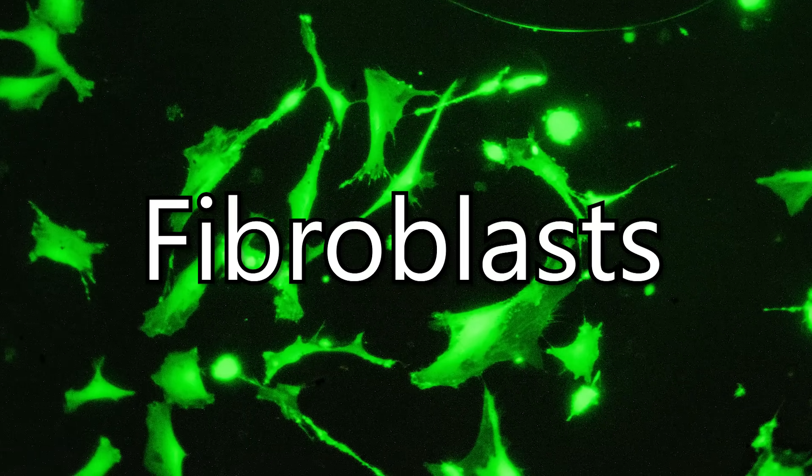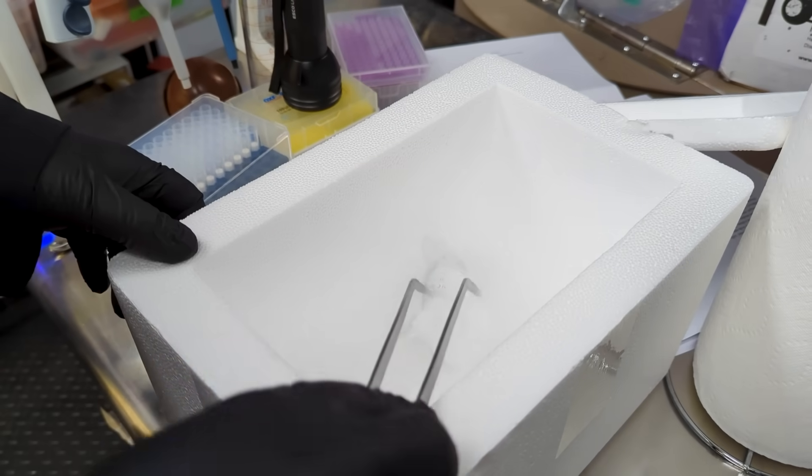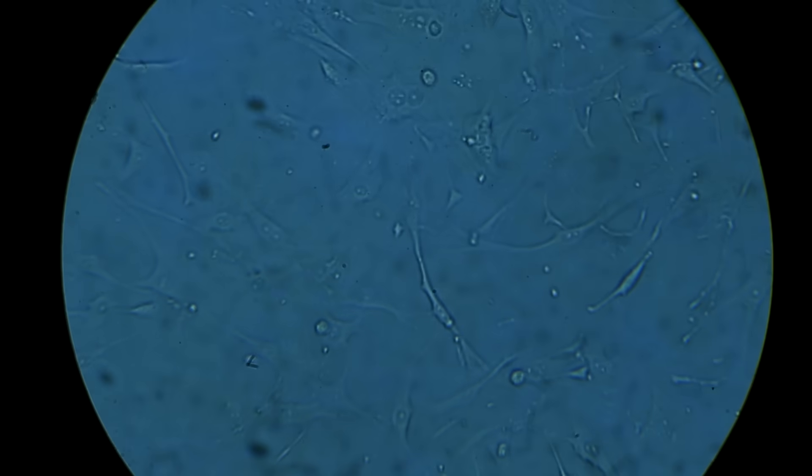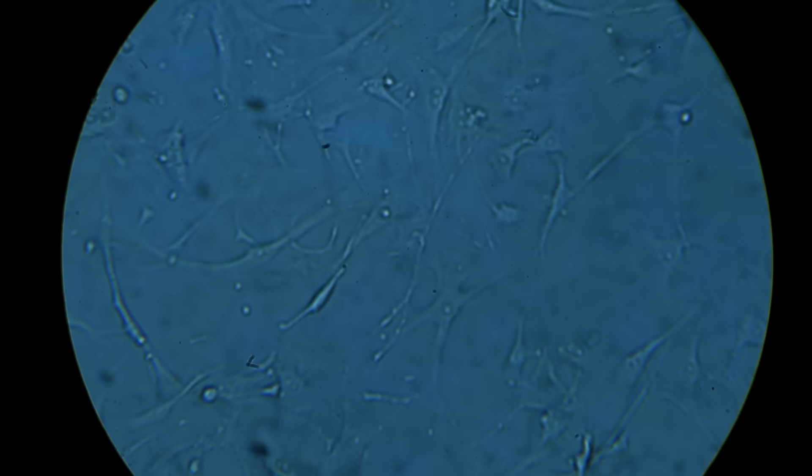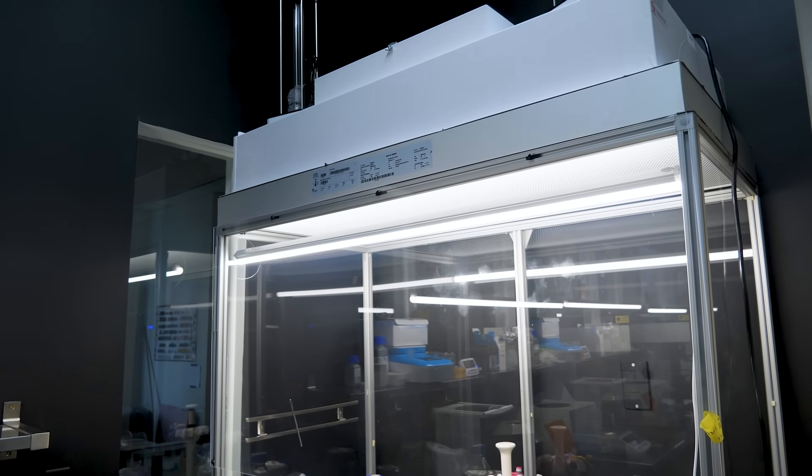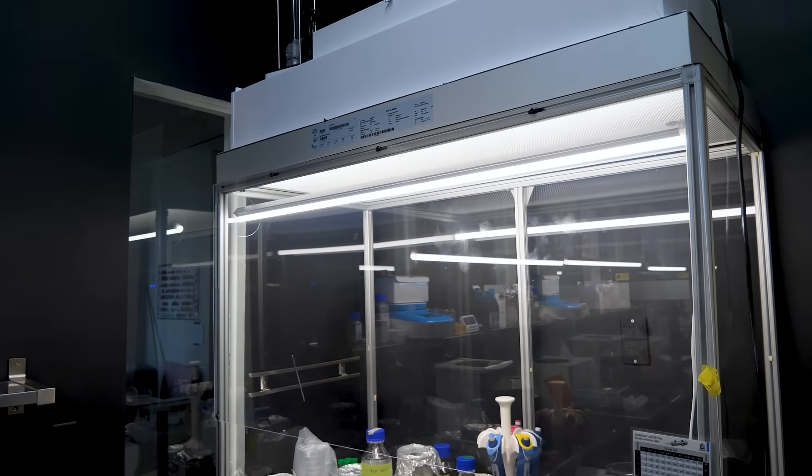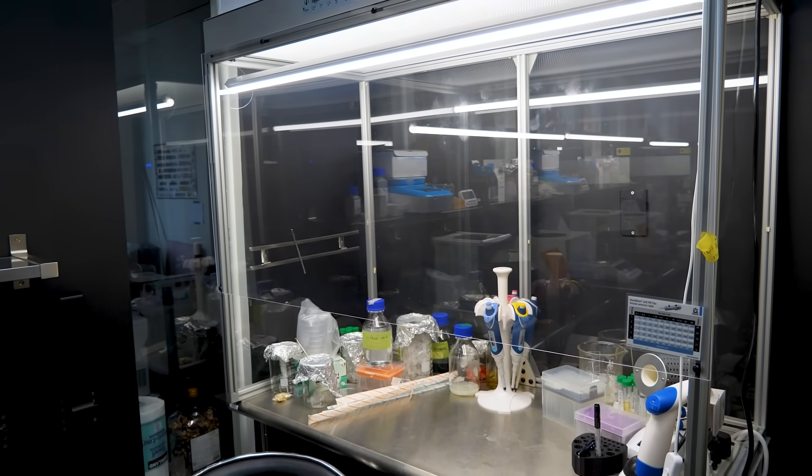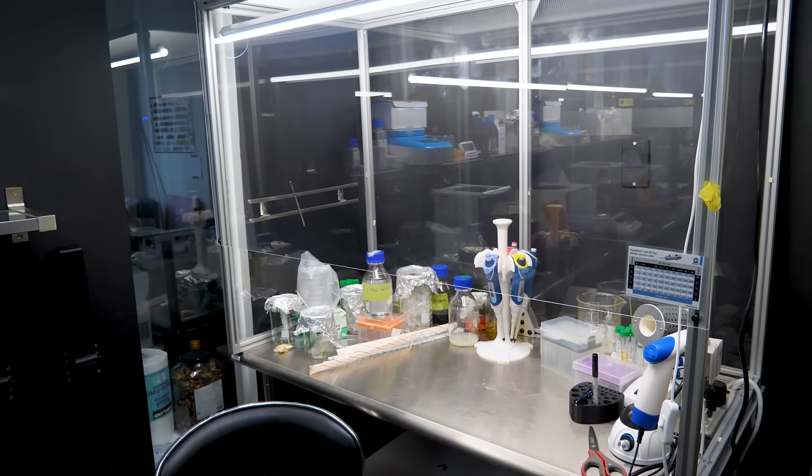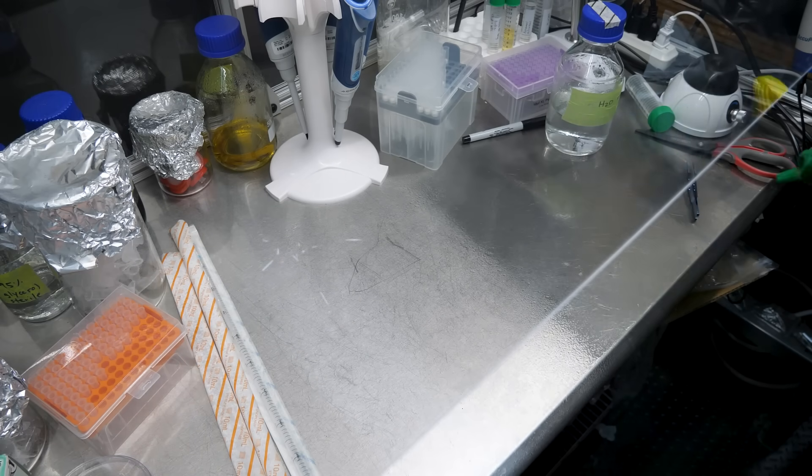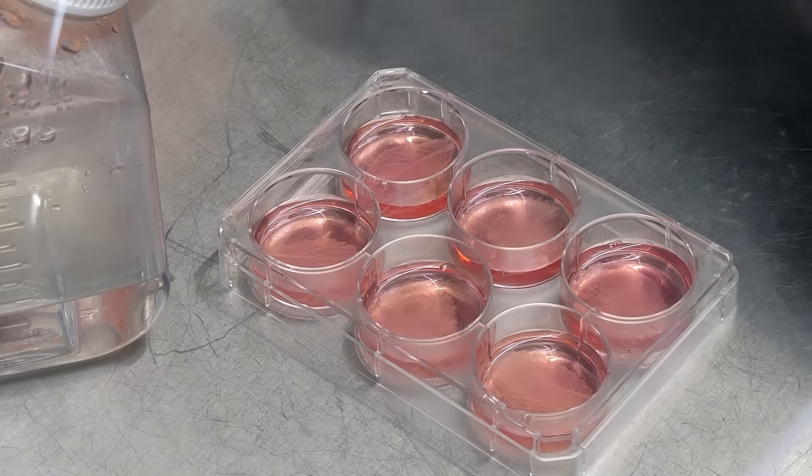In preparation for this project, I ordered some fresh cells and got them growing in a T75 flask. The flask at maximum capacity will hold about 8 million cells. When the flask was fully grown, it was time to seed the scaffolds. As usual, all this work is being done in our flow hood so that we have a clean, sterile environment. These cells lack an immune system, so if anything got into the cultures, they would rapidly die. Everything is sprayed with alcohol before loading it into the hood, and there's a particular way to handle everything that keeps the cultures clean.